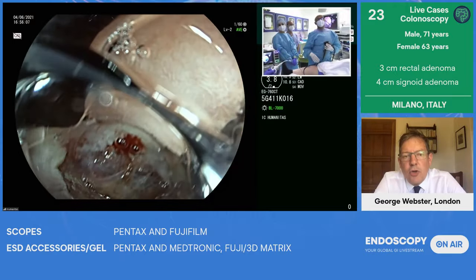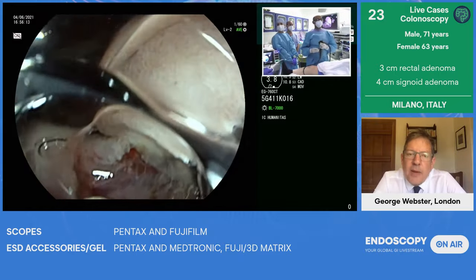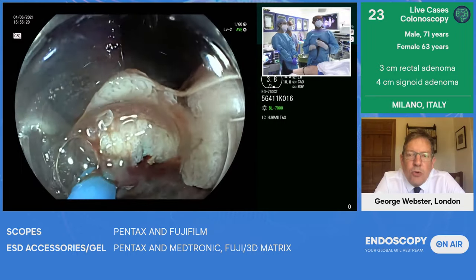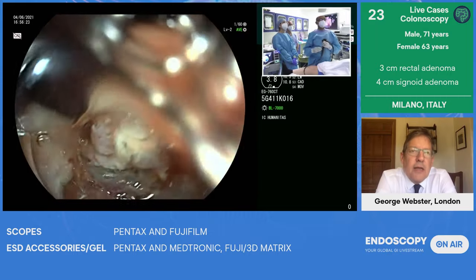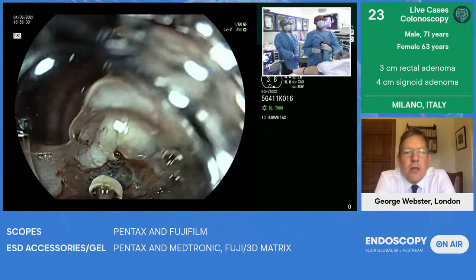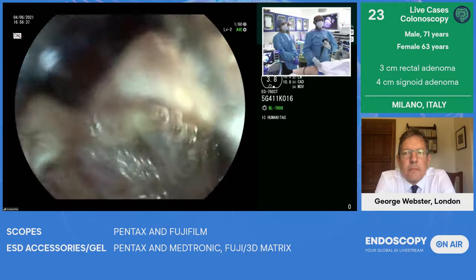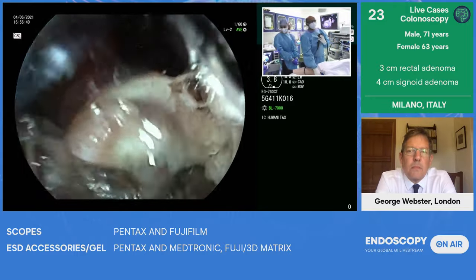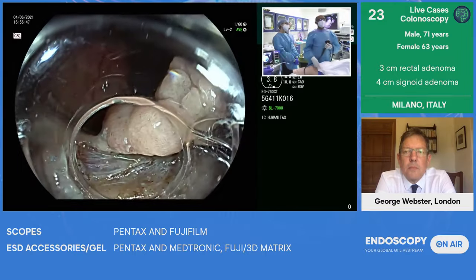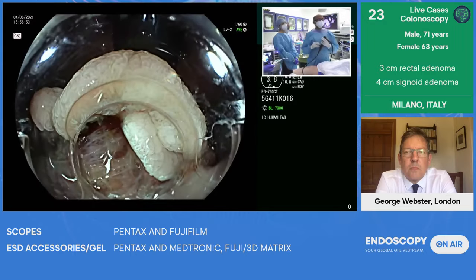We talk a lot about training and how endoscopists get their training in ESD. But do you want to comment about the team overall? These new knives have dual modalities. You're absolutely dependent upon skilled endoscopy assistants and nurses. Did you want to make any comment about that? This is teamwork, George. This is complete teamwork. My team knows when I need soft coagulation or swift coagulation. They're changing the diathermy setting without me saying. So it does require training the entire team, endoscopists, nurses, and the assistant, as well as your pathologist. Don't forget, if they don't give the right report, it's all a waste of time doing all this.